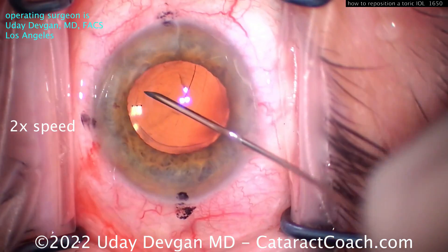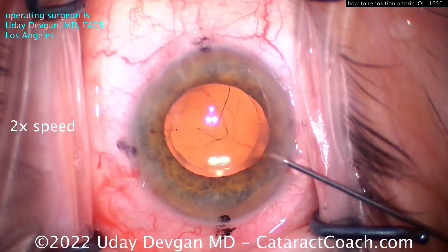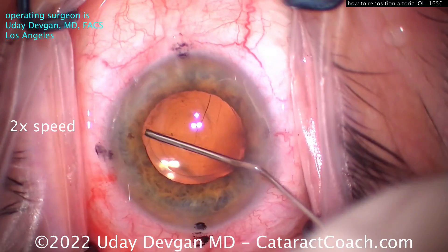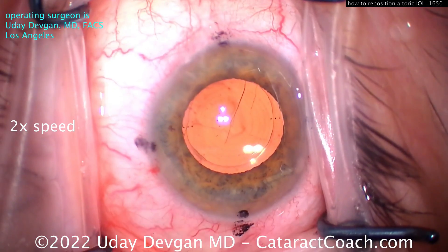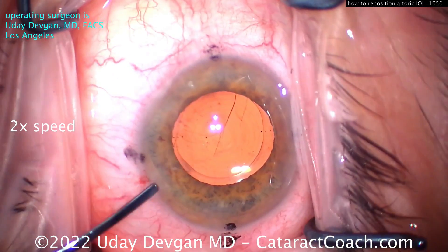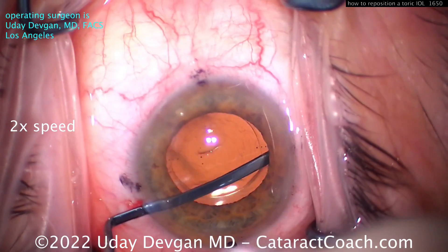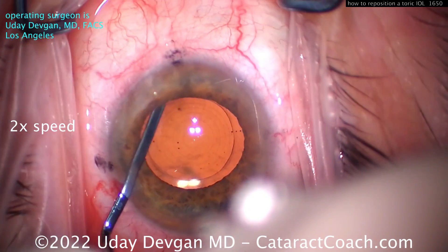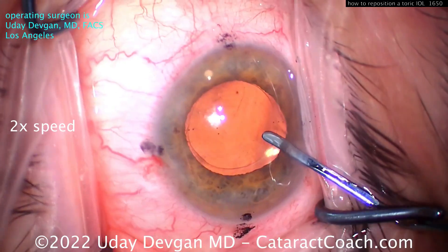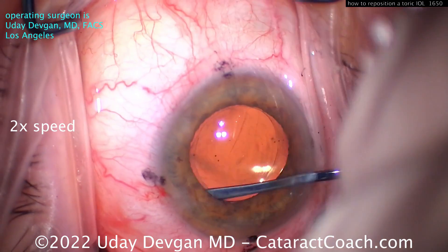You do not want to damage the rhexis edge. Remember, this patient has a toric trifocal — you want to keep it. You can't put a sulcus lens in; there's no toric sulcus lens, and there's no appropriate trifocal that's also a toric design for the sulcus. So we need to be cautious here. Now that it's opened up a little bit, I'll use my cyclodialysis spatula to help separate the capsular rim from the optic.